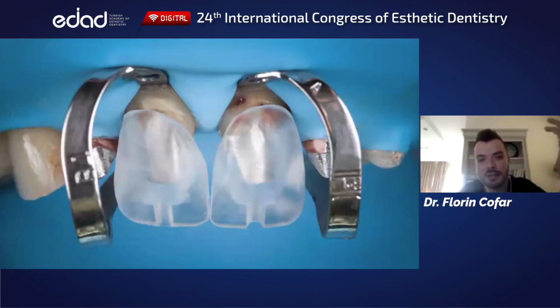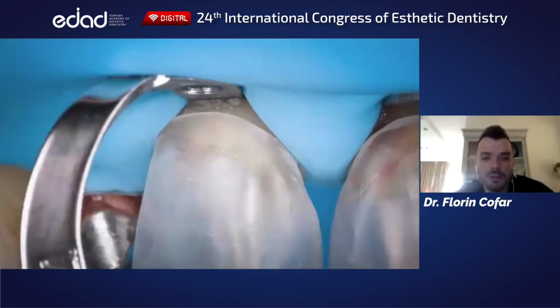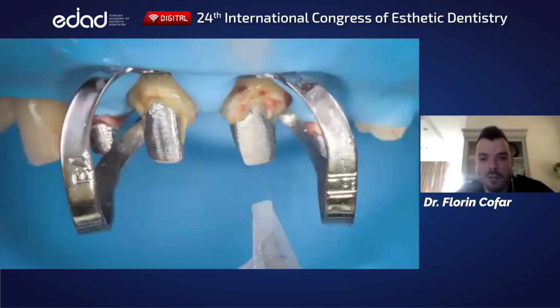And second, because what we're going to do is ask the technician to make the final design in a transparent PMMA, which is the final design on the outside. And on the inside, you will have the ideal abutment that will be ensuring the uniform thickness. And you can see this transparent PMMA is used as a carrier for the material that we're going to use to block the substrate. So here we're going to go with the adhesive steps.